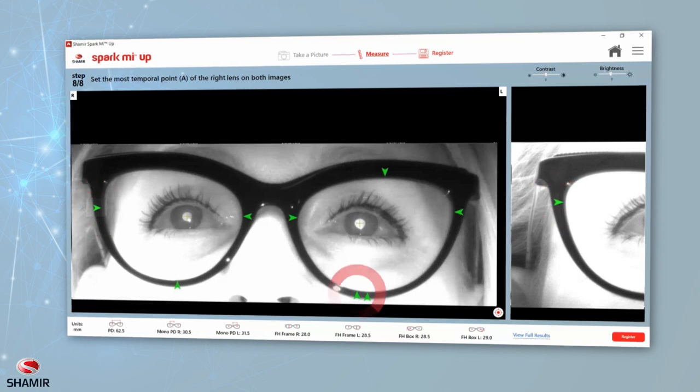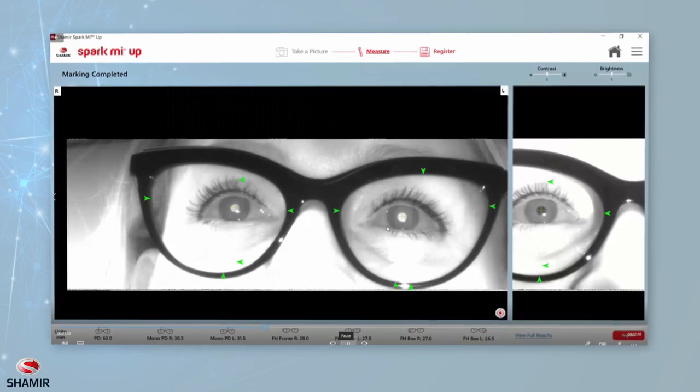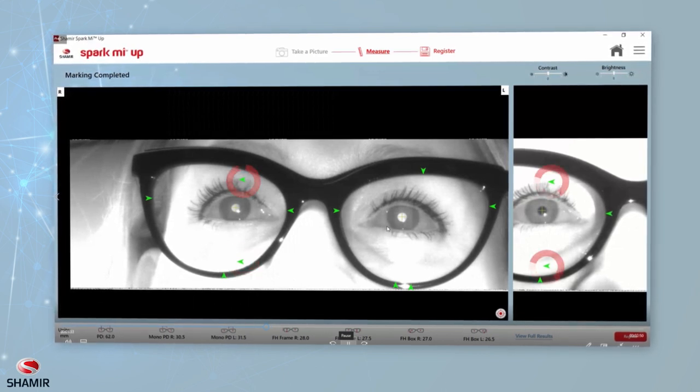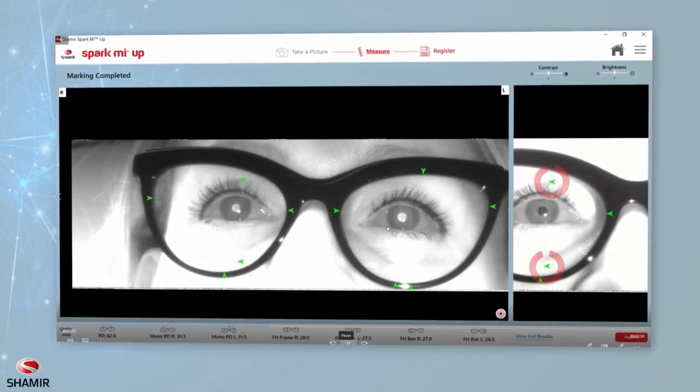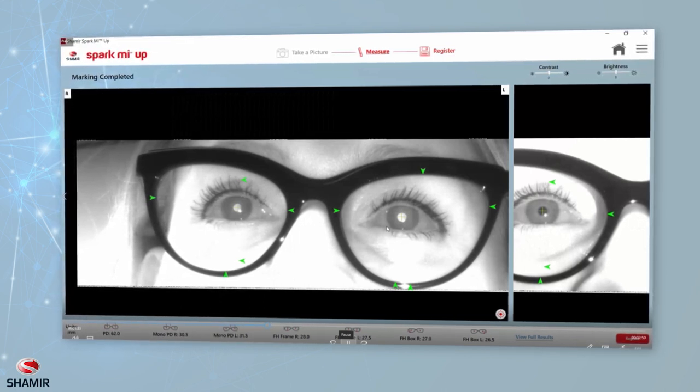Temporal point right and left should be marked on the primary image and then adjusted on the secondary image. To obtain full measurements, all eight points must be marked. Two additional steps are required if you choose the option of taking a new measurement with pantoscopic tilt. Low and high panto point of the right lens should be marked on both images. It is crucial that the exact same point be marked on both primary and secondary images.